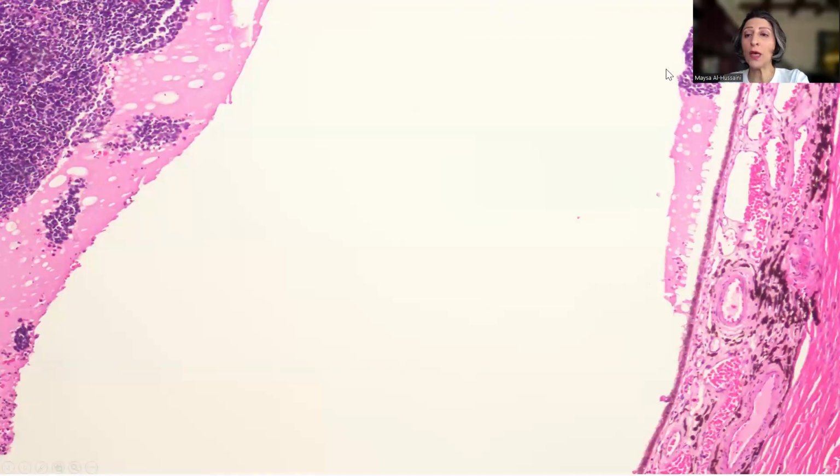And this is the choroid, where we have the pigment and we have the vessels. This is the pigmented retinal epithelium. This is the sclera. So this is towards the exterior part of the globe. And this is the tumor, which really what it did, it snatched with it the retina, causing retinal detachment and some fluid and hemorrhage in the subretinal space.